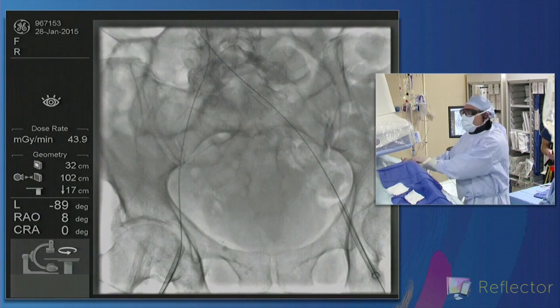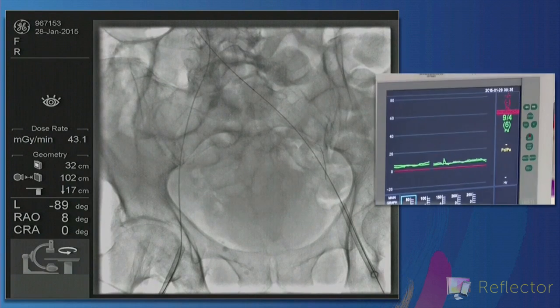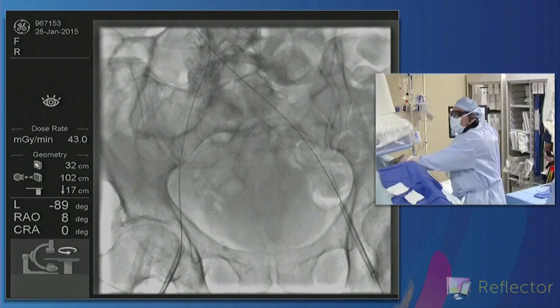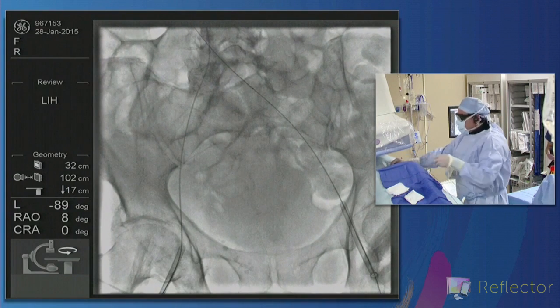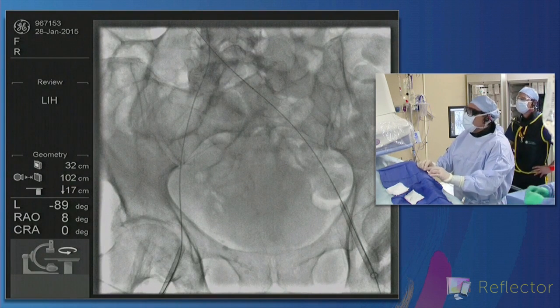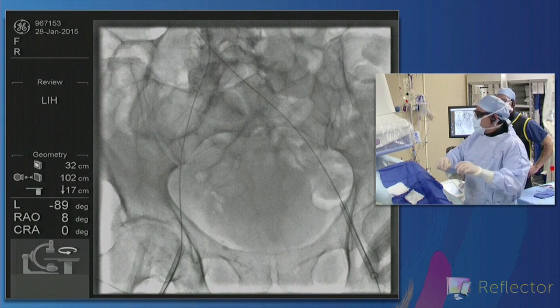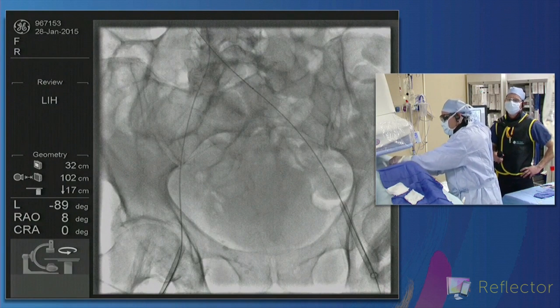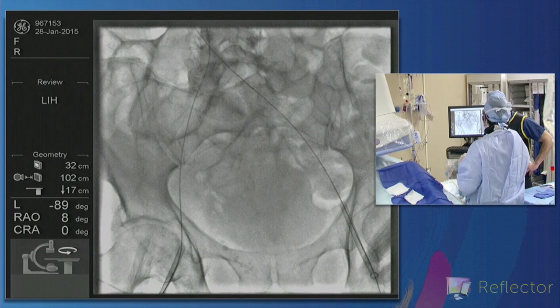I agree with the idea of doing IVUS, and I like the suggestions of dynamic maneuvers mentioned by both panelists. Typically, we put the patient in a little head up, foot down position to also increase the pressure in the pelvis and lower extremities. But if I come away unsure, then I do what every good angioplasty doctor does and get out an angioplasty balloon and be very gentle. I don't think there's a big disadvantage to checking to see if there's a waist on the angioplasty balloon, rather than make the guy come back or have some possibility that I've missed something. Yeah, I think that leads to another discussion where we have done that, got a great result with the angioplasty and stopped and not stented. I know that's heretical, but some patients with little focal lesions have done okay with that.